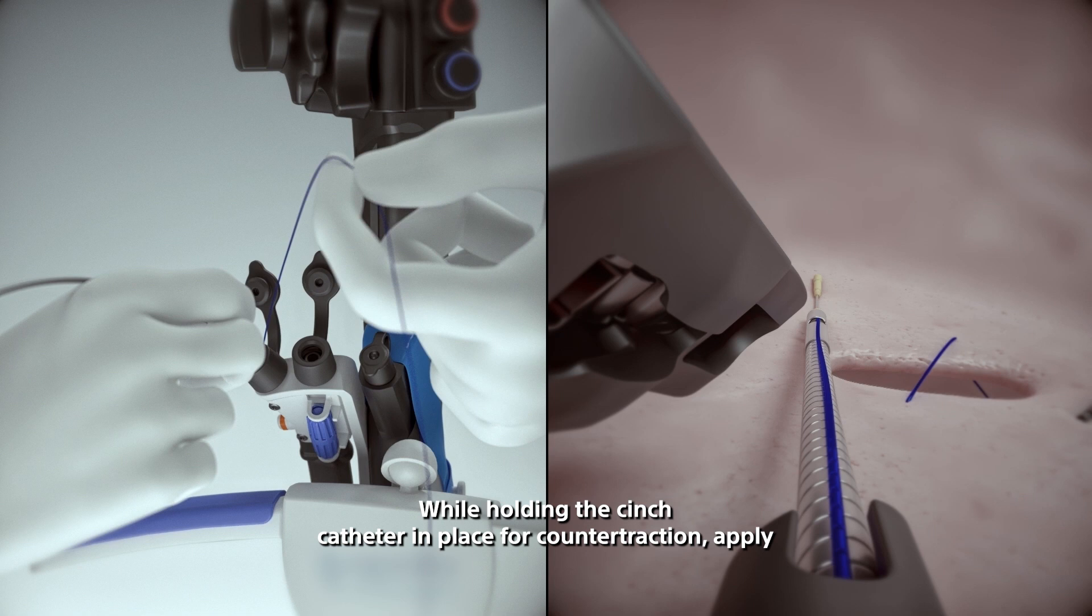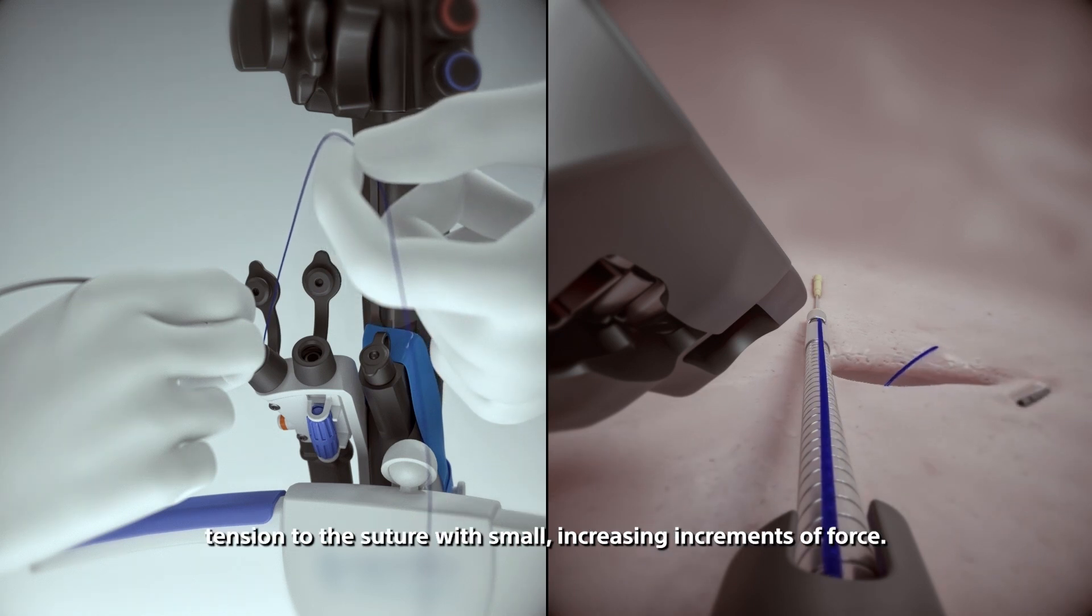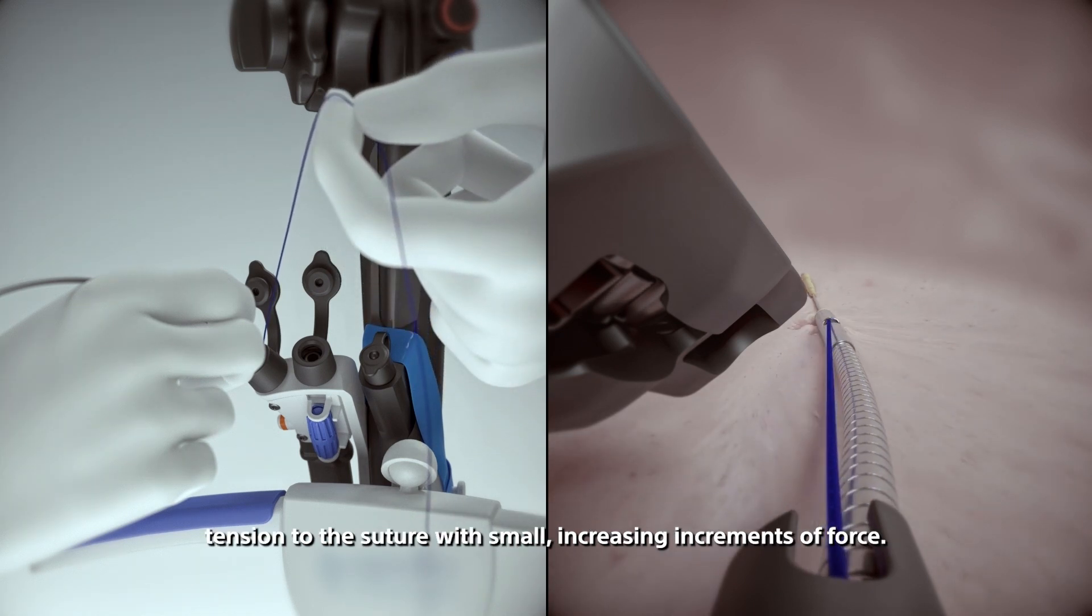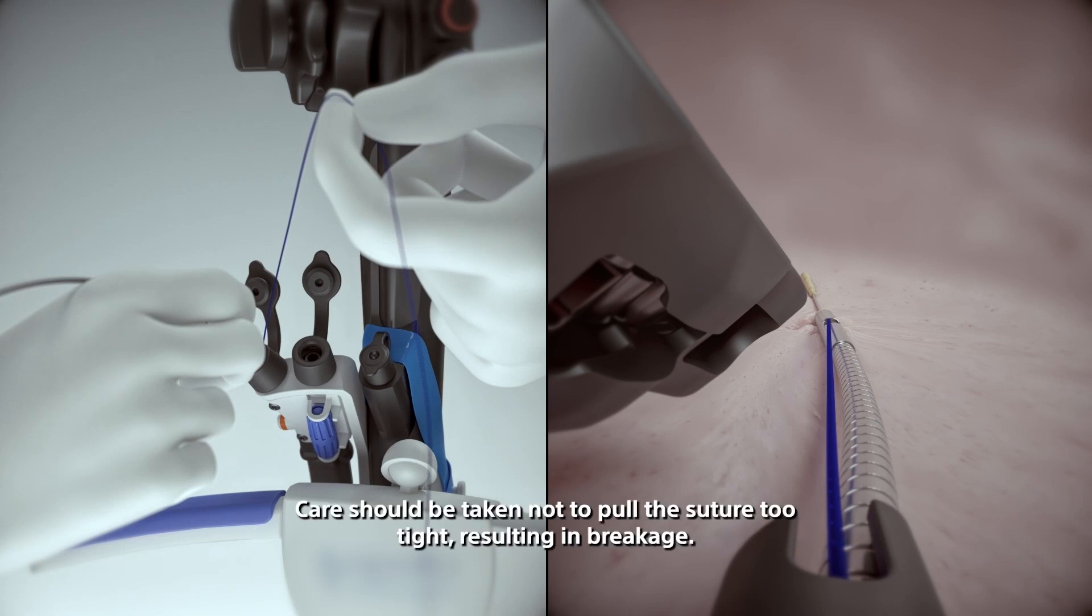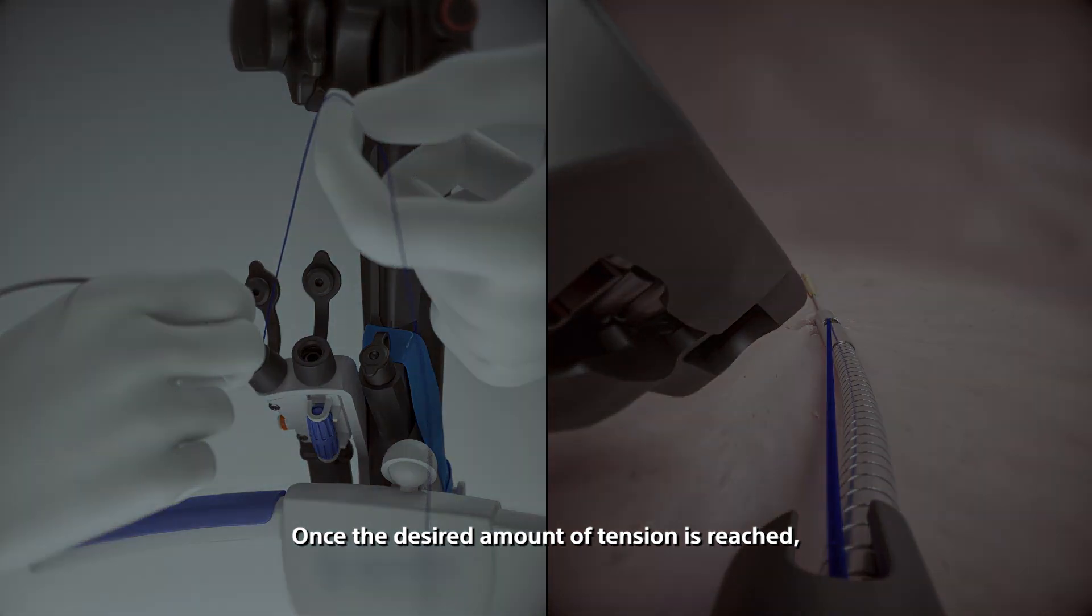While holding the cinch catheter in place for counter traction, apply tension to the suture with small, increasing increments of force. Care should be taken not to pull the suture too tight, resulting in breakage. Once the desired amount of tension is reached, open the cinch handle with the palm facing down.